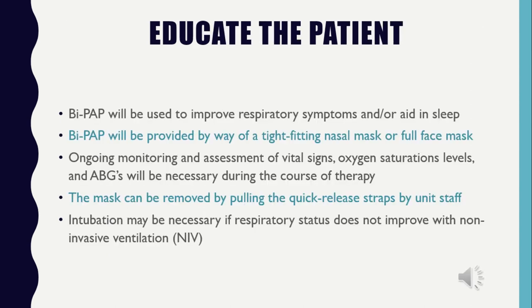Okay, we always want to educate the patient. This will allow for better cooperation. We want to let them know that this BiPAP machine will be used to improve their respiratory symptoms and also aid in their sleep. The BiPAP is provided by a tight-fitting mask, a full face mask, and we will have to let them know that that is part of the treatment. We're going to be monitoring them, vital signs, oxygen, ABGs, and then just throughout the whole process, and then we'll see when the physician will want to end the treatment.